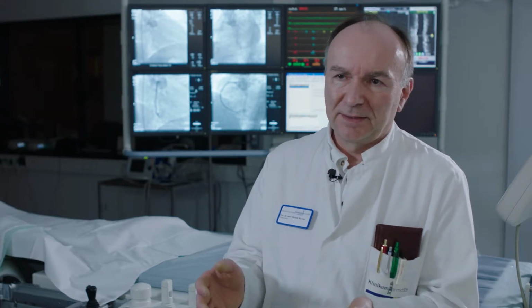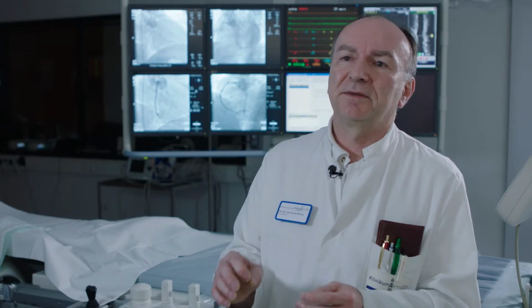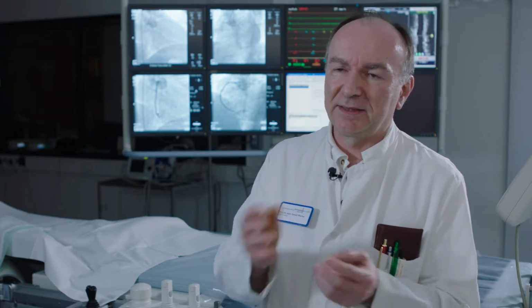And during the procedure, whenever we get into a problem of ambiguity of the proximal cap, we need to have imaging within the lesion. So I would think a good CTO operator is someone who applies IVUS, even with the financial restraints that we have, especially in Europe, with wisdom and efficiency, and then IVUS reduces your procedural investment even, because you plan better, use the proper balloon, and it will achieve a better procedural result.